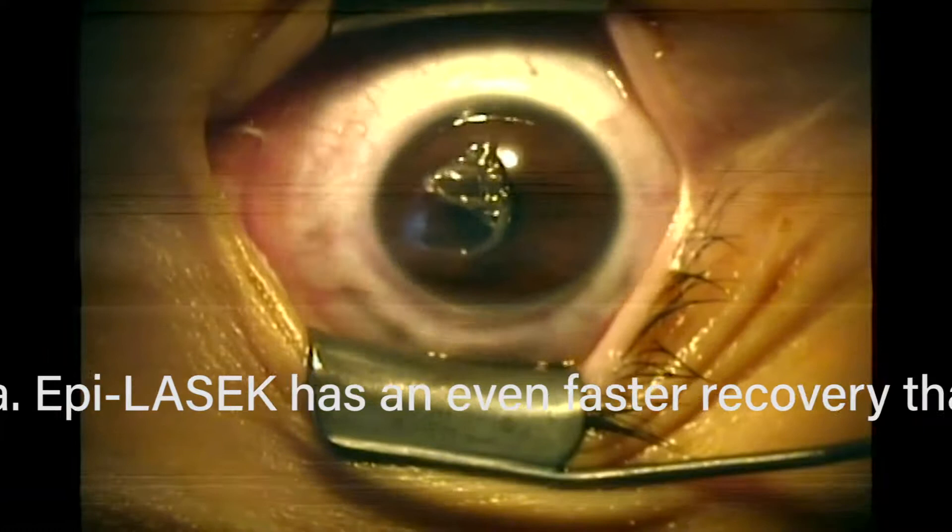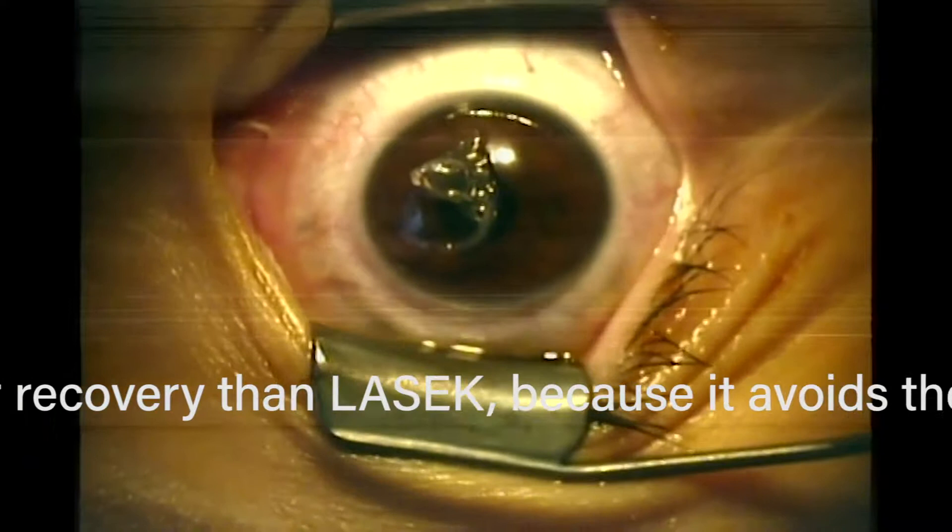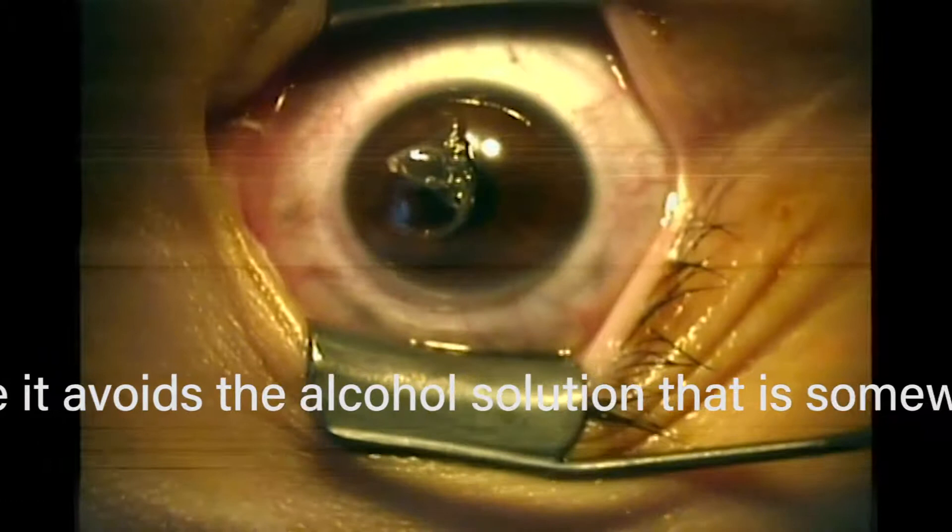At the end of all these laser vision correction procedures, we're just changing the shape of the cornea so it has a different curvature afterwards, matching it up to the curvature of your glasses or contacts. So you'd have built-in glasses or contacts, and then you wouldn't need them because we just made the cornea like glasses or contacts.